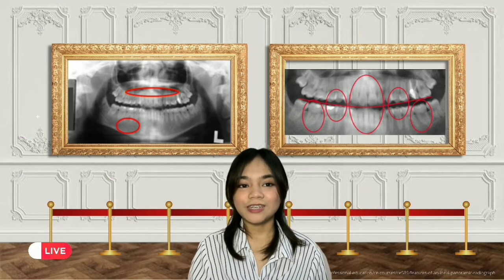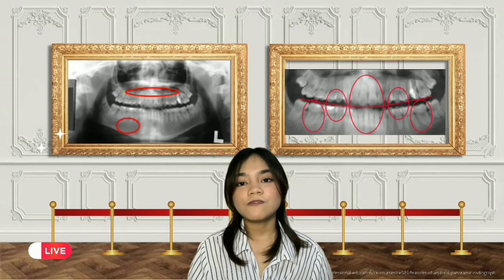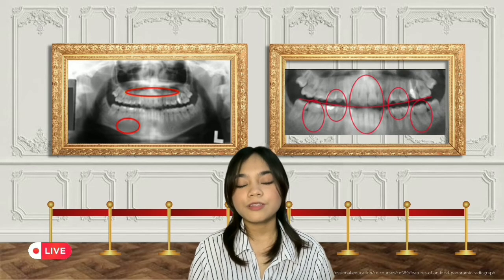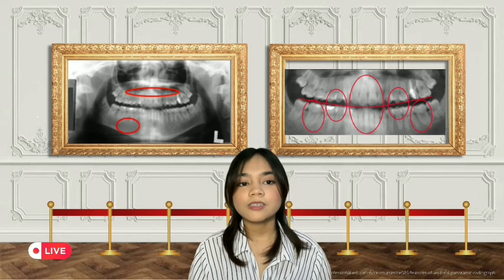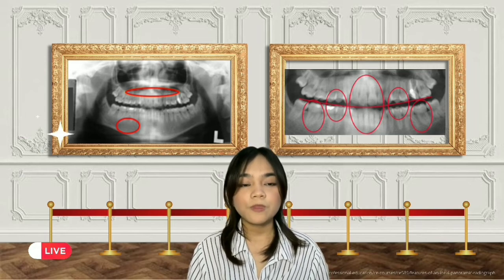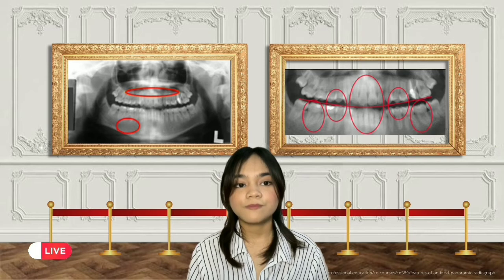On the image on your right, we can see red circles or oblongs, right? So these are the features of the dentition that we can use to assess if the teeth, particularly the anterior teeth, are positioned correctly within the focal trough. So, no or slight upward curve of teeth, no tooth size discrepancy on the left or right side, anterior teeth in focus, anterior teeth shape should be normal, not too wide or too narrow. Premolars will always overlap due to inherent X-ray beam projection to the arc of the teeth in this region.